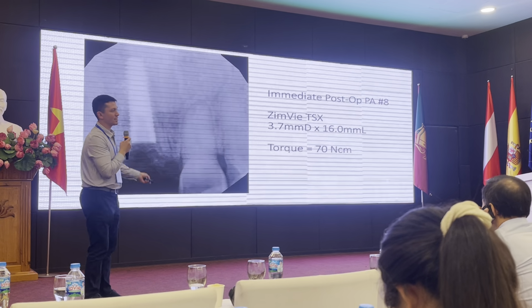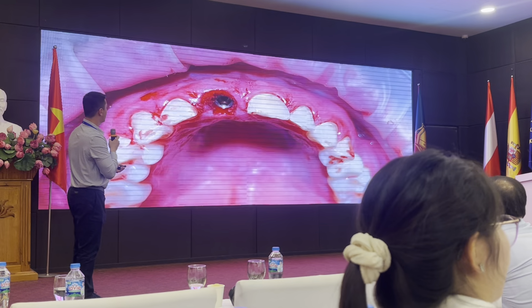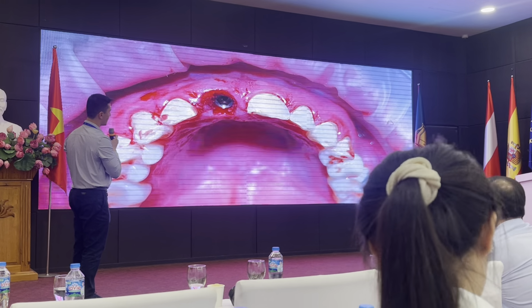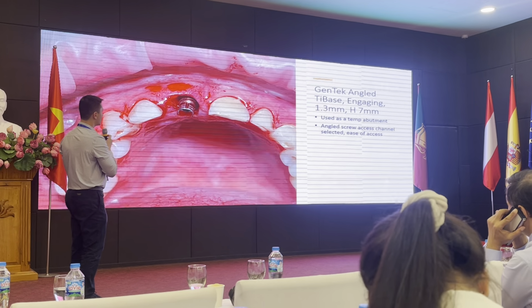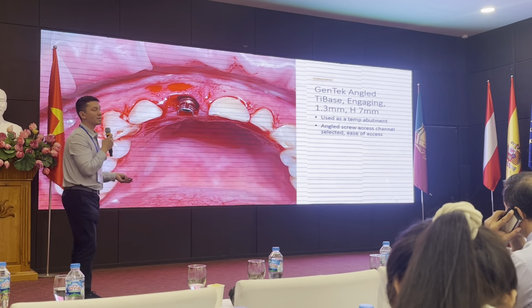Now we still have to design a provisional implant restoration. We want to do soft tissue shaping. So we place our implant. We also put particulate bone graft on to graft the bone to implant gap here. There's no incisions. There's no crestal, sulcular, or vertical releasing incisions because we didn't need to.